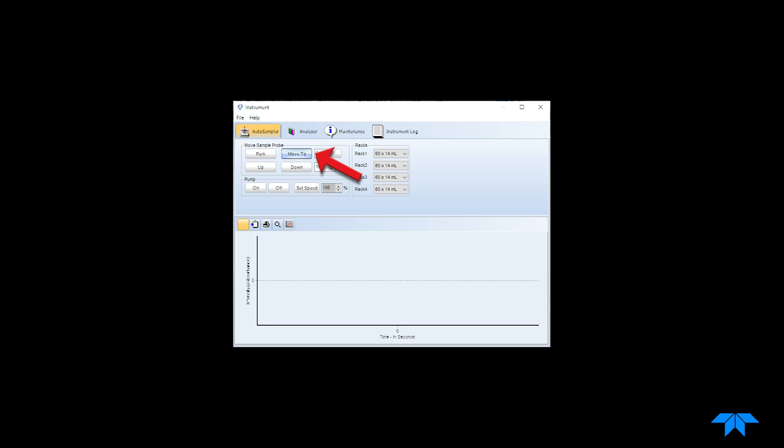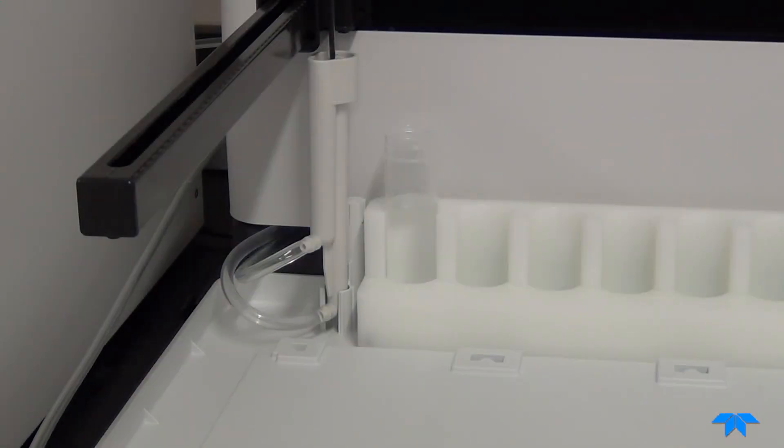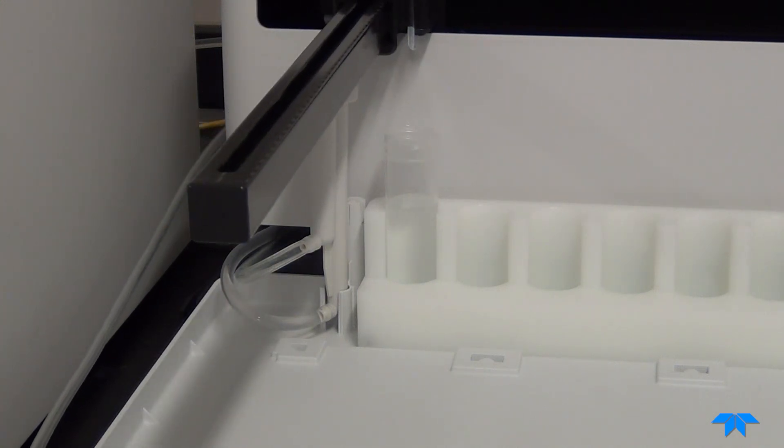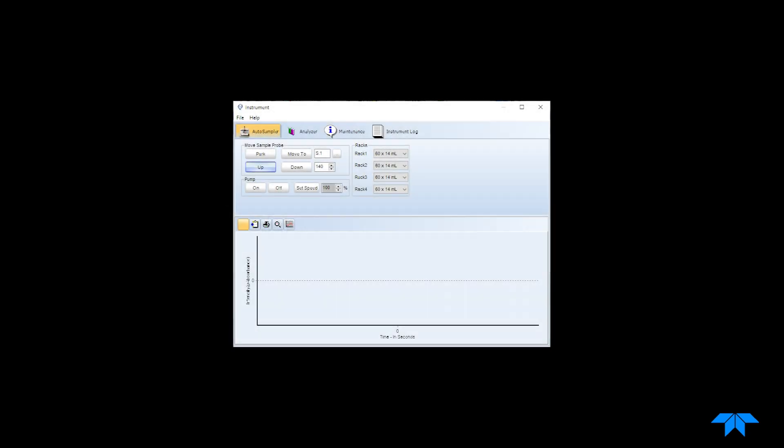Next, click move to. When you are ready to start your one minute timer, click down. After one minute, click up in the software.